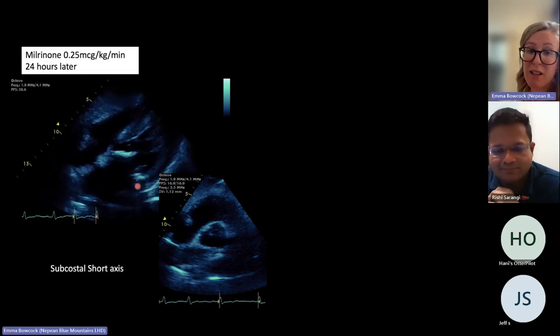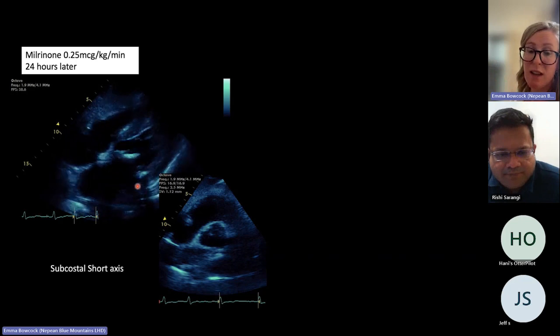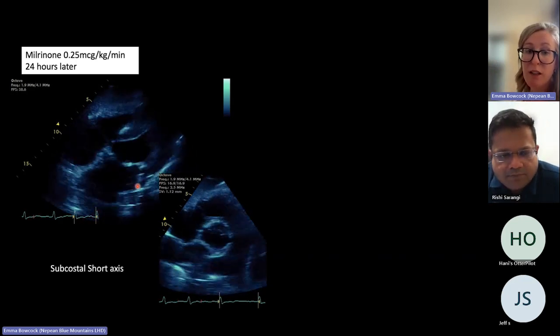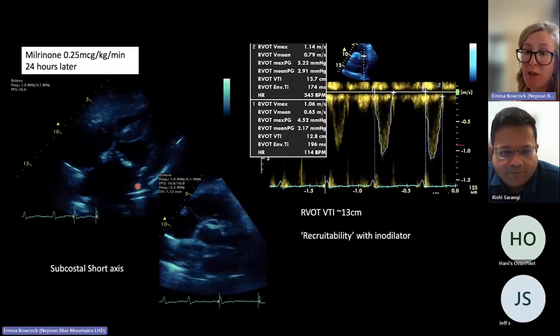This is what we need to be looking at. It's the trends, right? A lot of the studies are just looking at snapshots. And so we get a slightly better view this time, already eyeballing it, it looks a bit better. It's now gone up to 13.